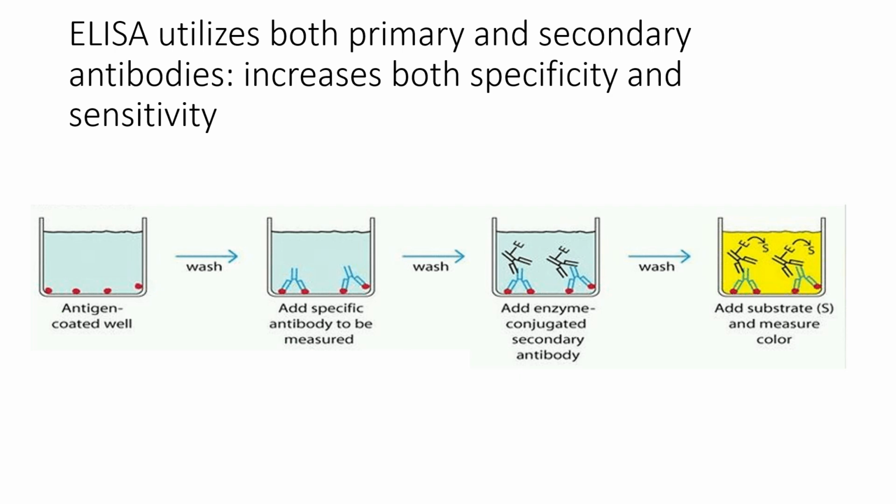This is the well that we would be using in our lab. We would do it in triplicate, but I don't have a picture of that. You can take somebody's sample. It could be from their saliva if I was looking for if they had mono. I could take their blood if I was looking for HIV. And put that sample into a well.